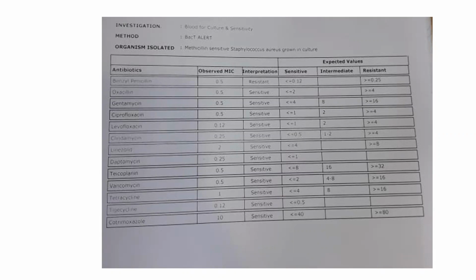When we order the blood culture, bottles are sent to us. When we draw the blood culture, it is put in those bottles, which have liquid culture media, an enrichment broth that facilitates the growth of bacteria compared to direct agar plates. So the blood cultures are collected in these bottles and incubated in automated incubators.